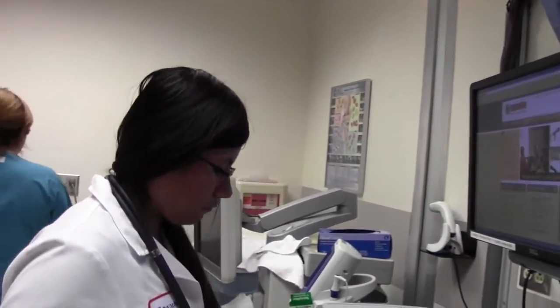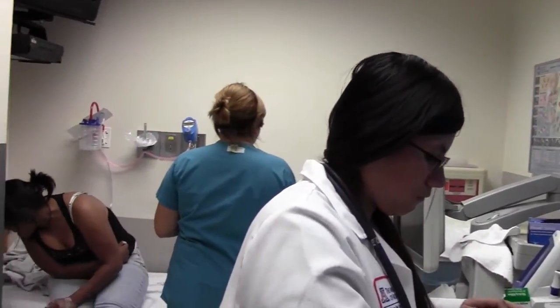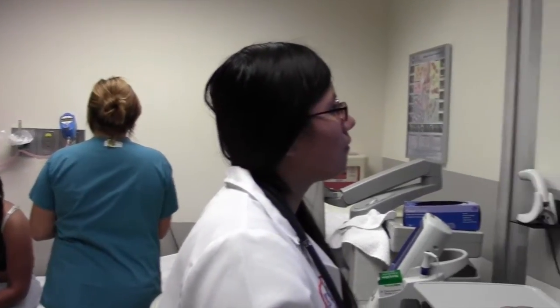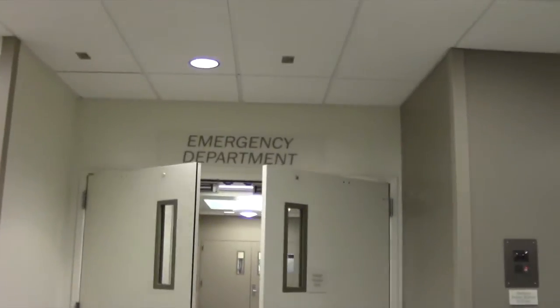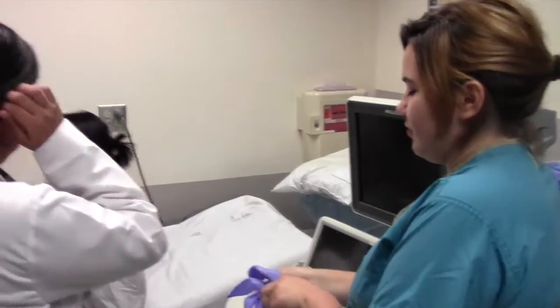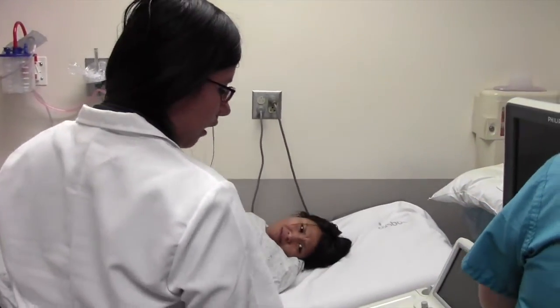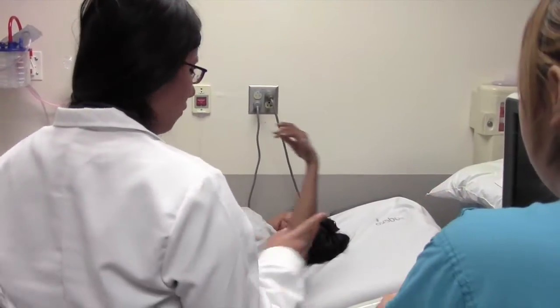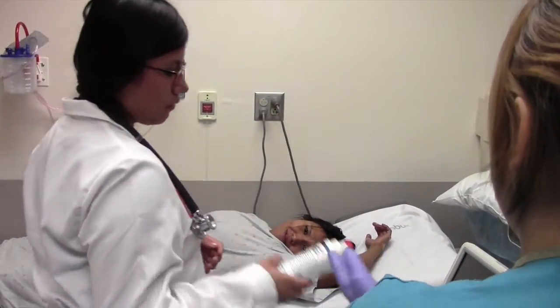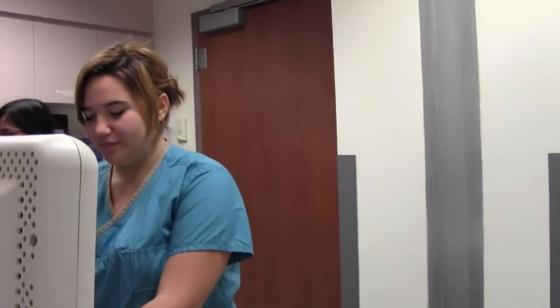The doctor will now order an echocardiogram to see what is going on, which seems to be a heart defect. An echocardiograph machine is an instrument that in a painless and non-invasive manner employs the differential transmission and reflection of ultrasonic waves to image structural and functional abnormalities of the heart.